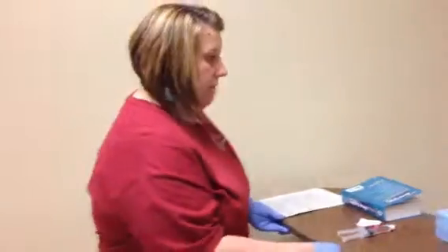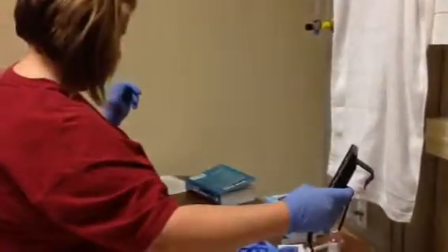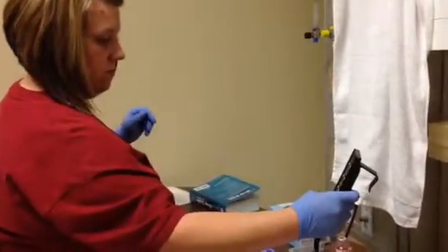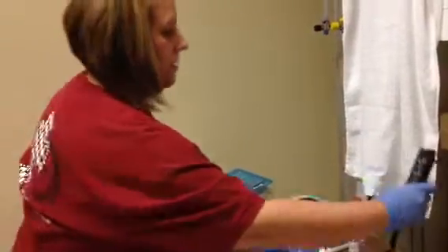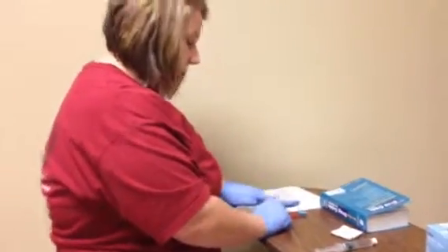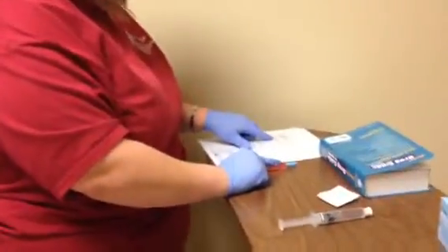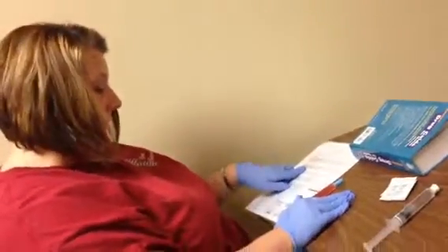All right, Mr. Dunn, I'm going to raise your bed up just so I can get to your IV a little better. I'm going to do my third med check. I'm at the bedside. I've got my label. I've got my Demerol 50 milligrams IV. Okay. I have diluted it with 5 milliliters of saline.